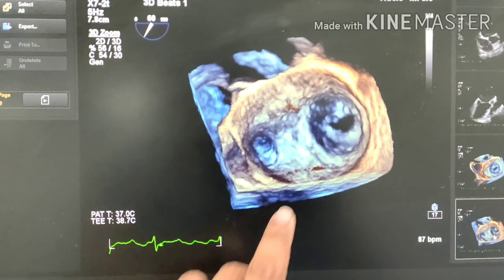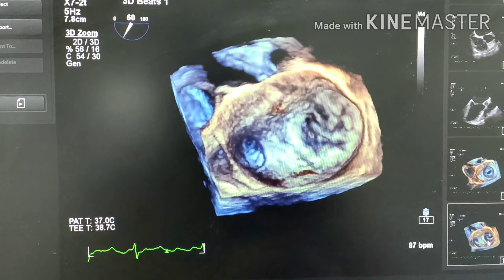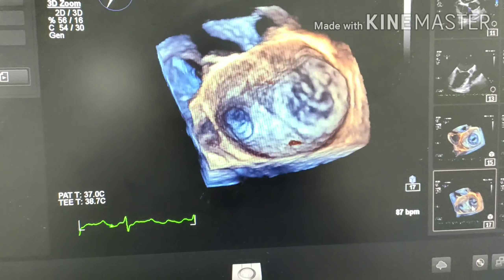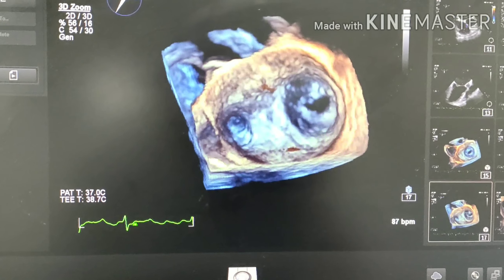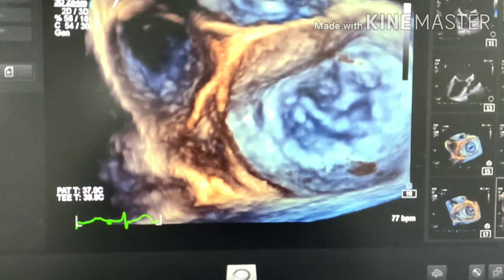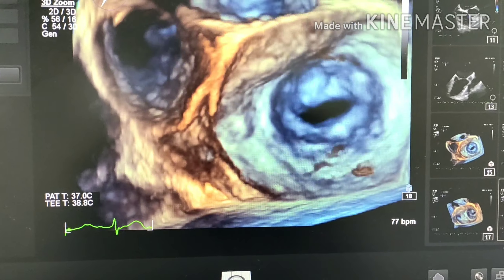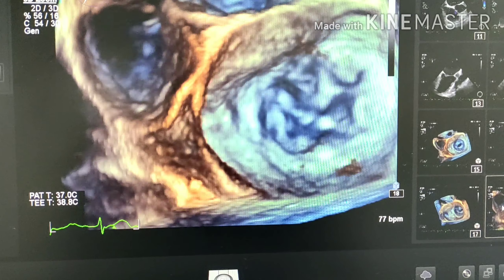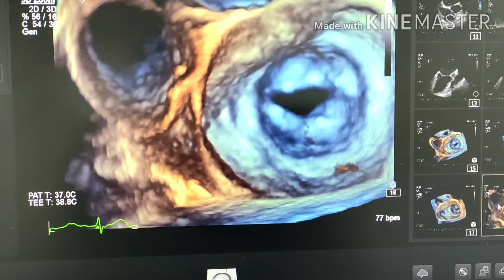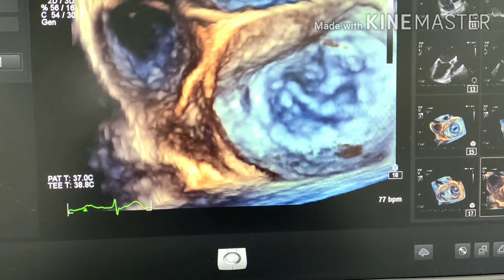You can see the stenosed mitral valve and the extent of the commissural fusion. It is almost like a fish mouth. This focused view gives a good look at the stenosed mitral valve with commissural fusion.